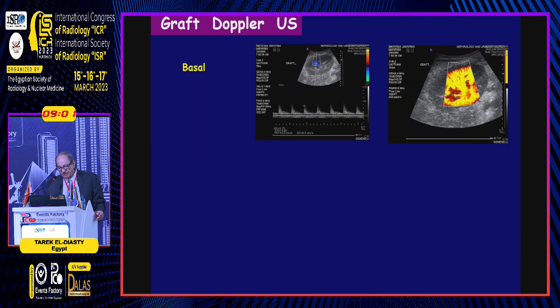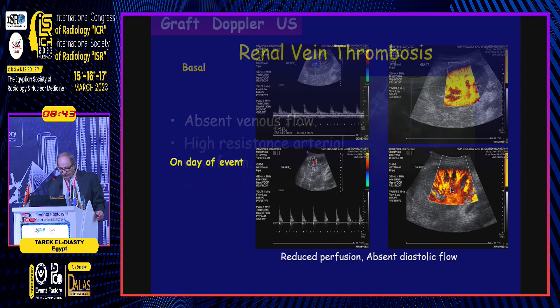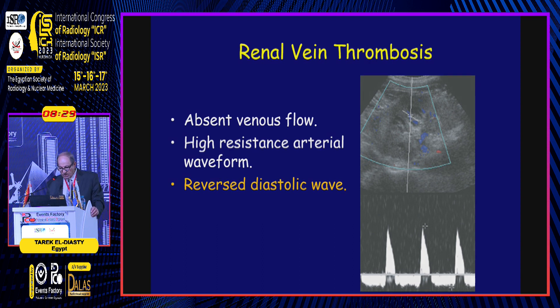In a case of a kidney transplant recipient, baseline power Doppler mode shows good perfusion. One day after the event, there is reduction of power flow. On follow-up, absent venous flow and high-resistive arterial waveform with reversed diastolic flow are observed. Reversed diastolic flow is highly suggestive of renal vein thrombosis.